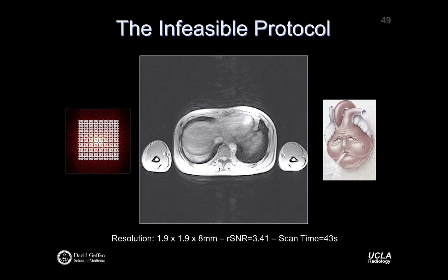What's the phase encoding direction for this image? Yeah, see Hayden pointing up and down like this, right? So phase encode direction is up and down. You can see this respiratory motion artifact throughout the object, outside the object.